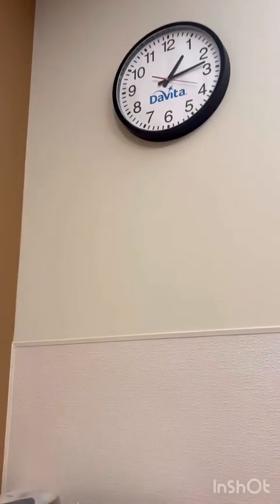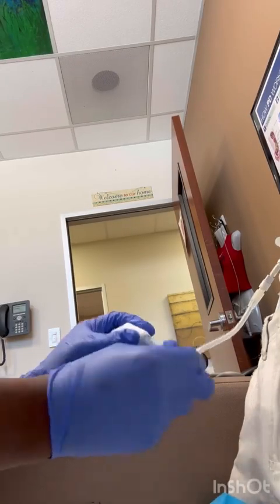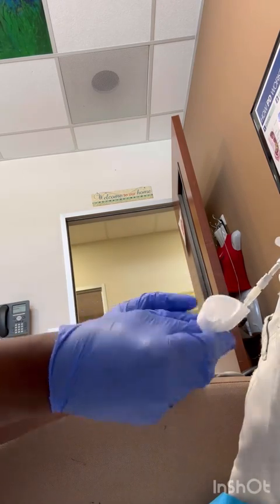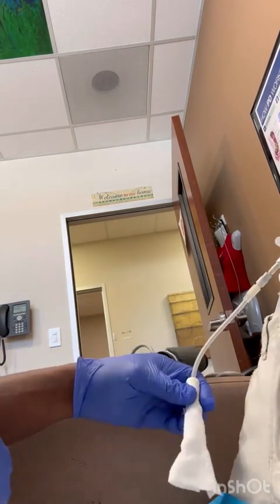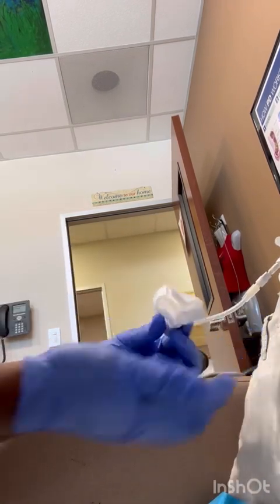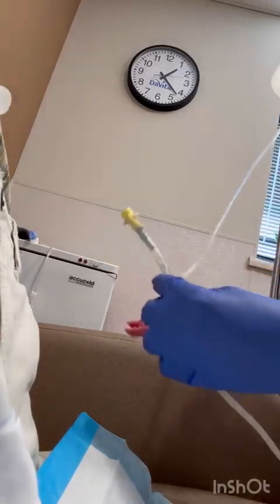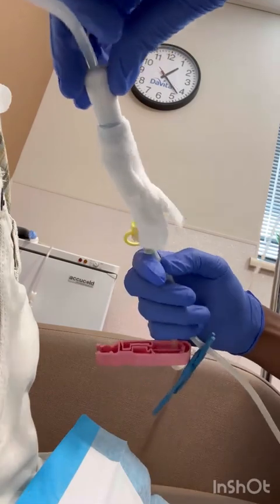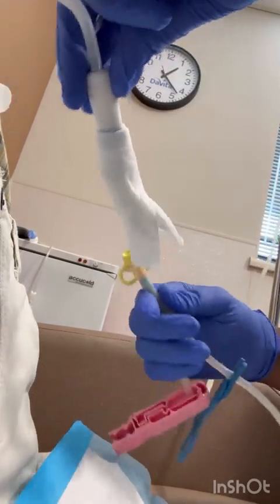After I scrub for one minute, I'm going to take my second piece of gauze and wrap it around his transfer set for one minute. Normally Steve has legs or some kind of workstation he could put his transfer set on, and he can grab his connector right there. After that one minute's done, one hand grabs the transfer set, the other hand grabs the connector.